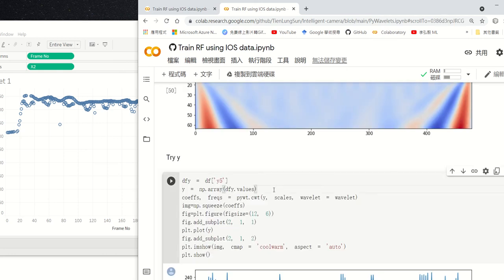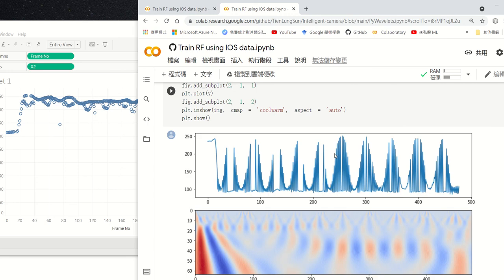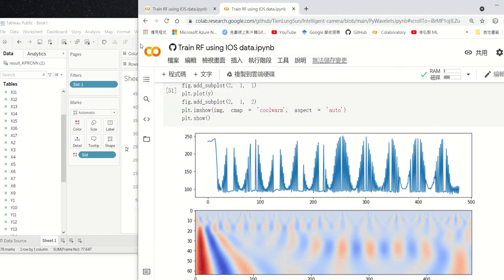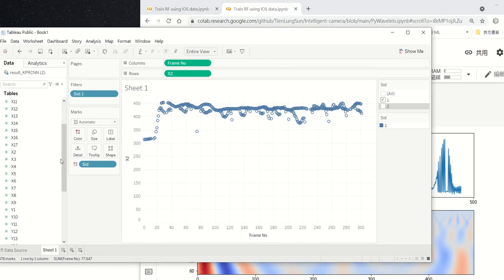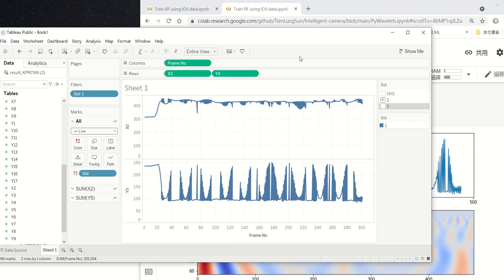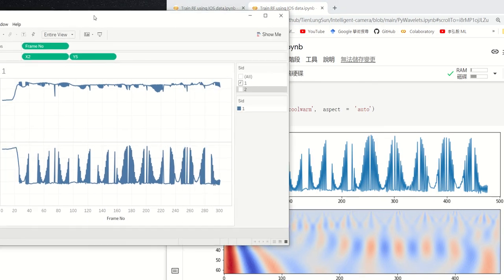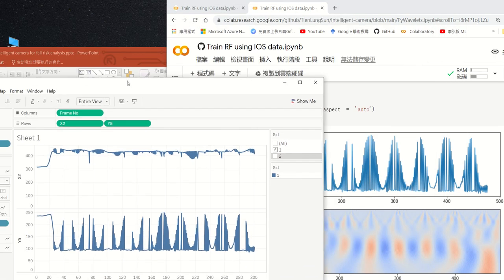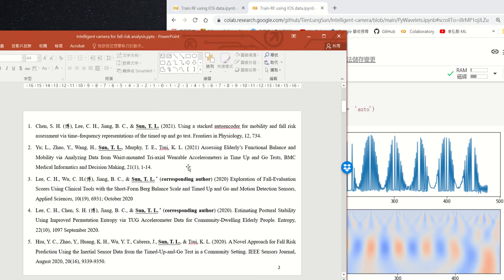Or we might try using Y, for example Y5. Let me drag Y5. Tableau is very convenient. I recommend you open both my GitHub Python program as well as Tableau during your data analysis. Maybe let me change this to line. As you can see, that's the time frequency. For more details, you might refer to our publication, or I will ask Shihai, Qihan and Jiaxuan to explain these details later.